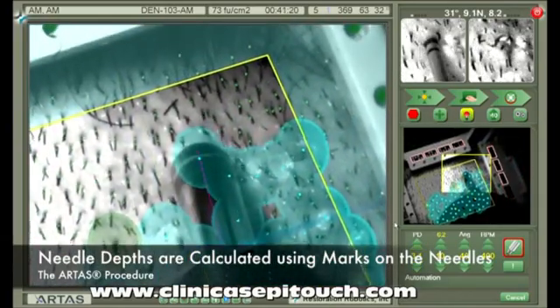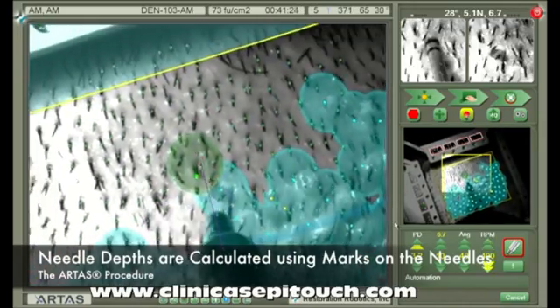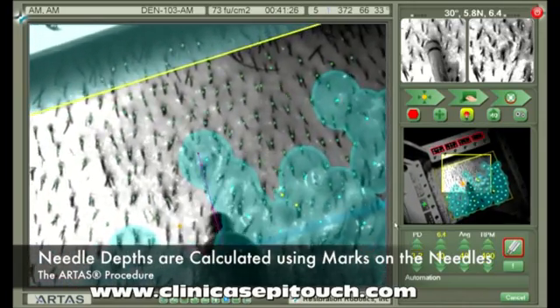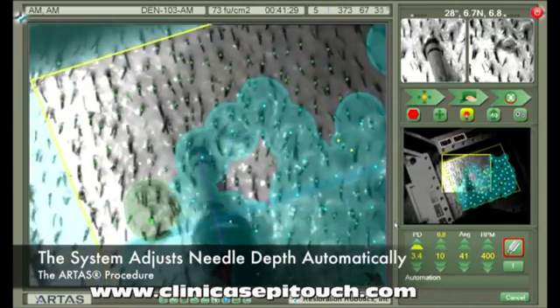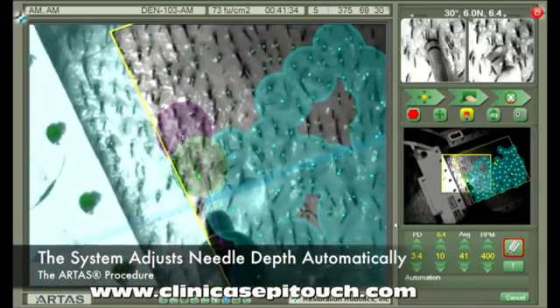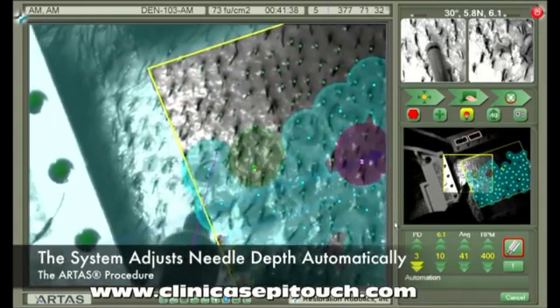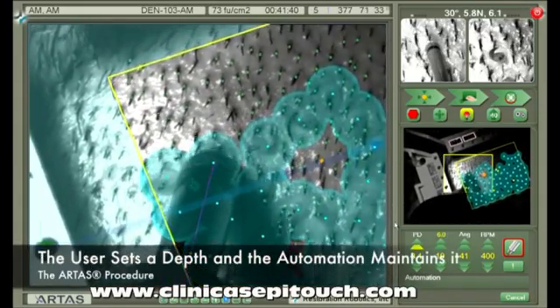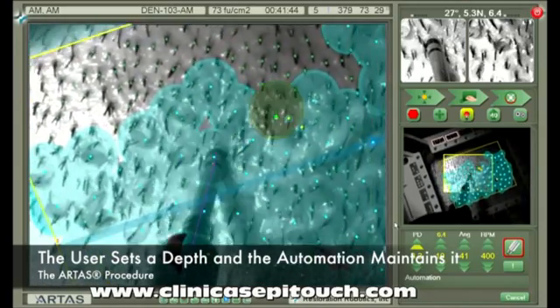First, let's look at PD. PD stands for puncture depth, which is the depth of the sharp inner needle — the first needle to enter the scalp. There are marks on the outside of this needle, as you can see in the upper right-hand corner of the screen in the still image. The system tracks these marks and automatically maintains the desired depth set by the user. The user simply sets a depth, and the automation maintains it.